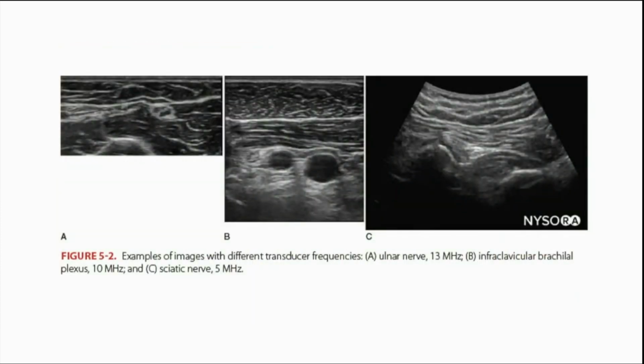Examples of images with different transducer frequencies. This one is the high frequency, this one is the lower frequency.